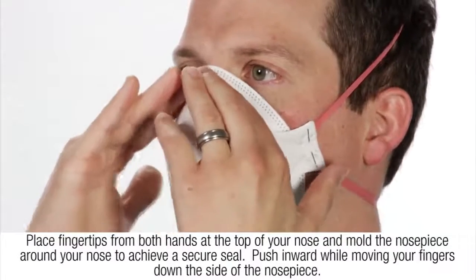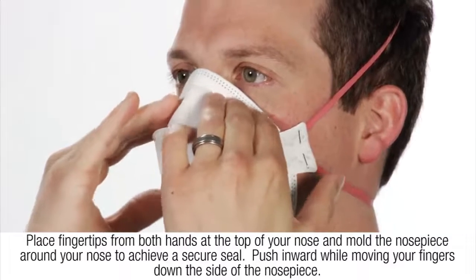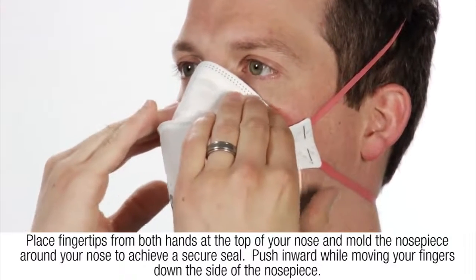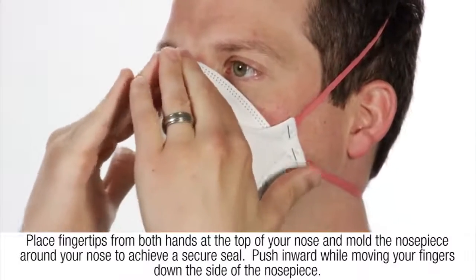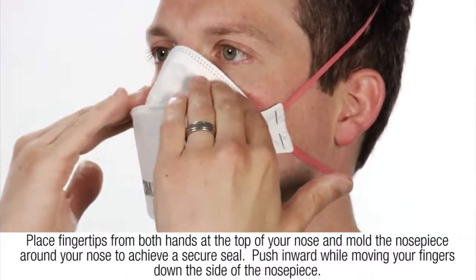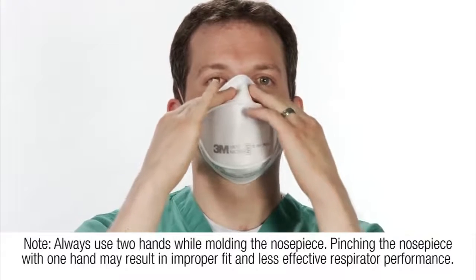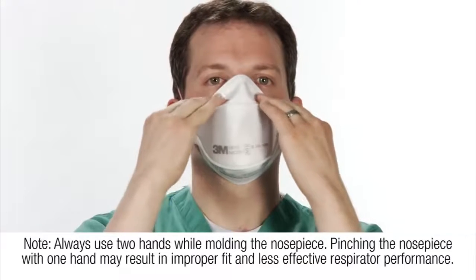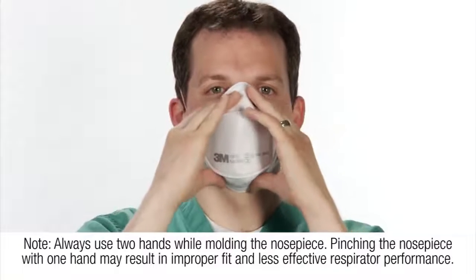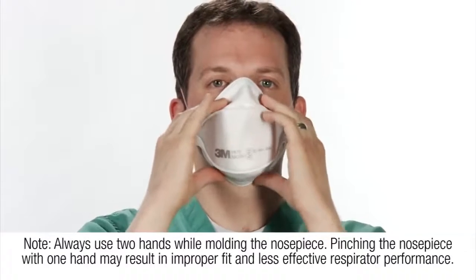Place fingertips from both hands at the top of your nose and mold the nose piece around your nose to achieve a secure seal. Push inward while moving your fingers down the side of the nose piece. Always use two hands while molding the nose piece. Pinching the nose piece with one hand may result in improper fit and less effective respirator performance.